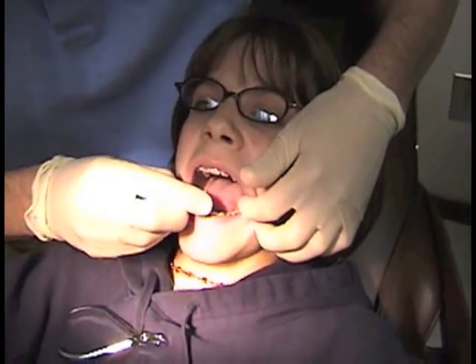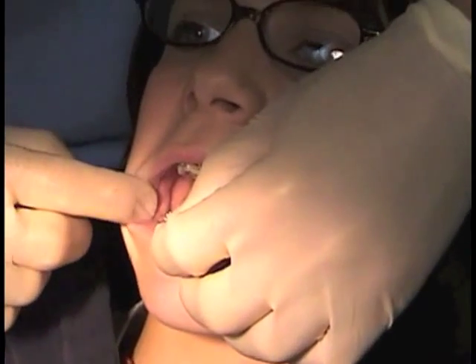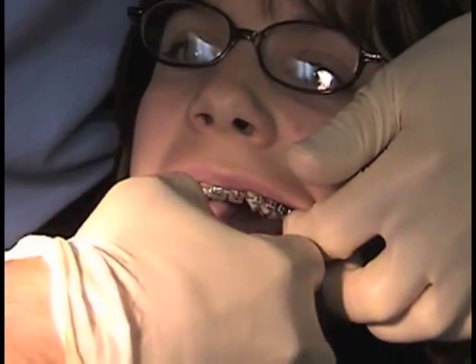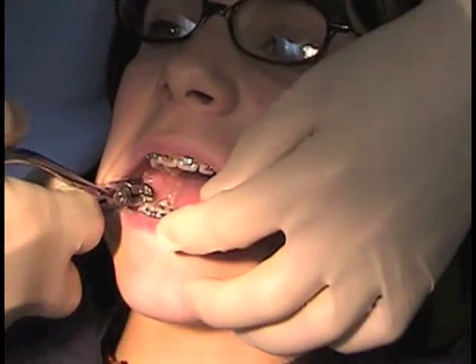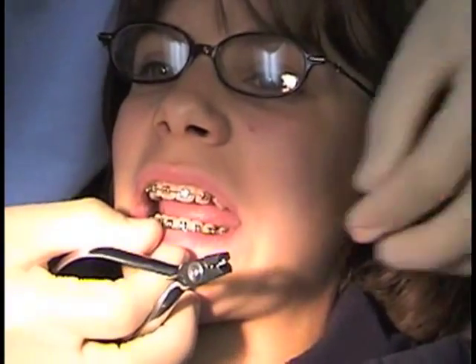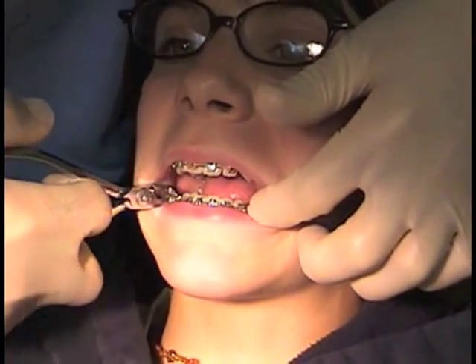We'll make sure we get the wire so that it's about a half an inch too long. So we've clipped it so that it's just a little bit long. Then when we cut the wire to the final length, we won't be cutting off the portion of the curve. So you can see the wire is just a little bit long on both sides.